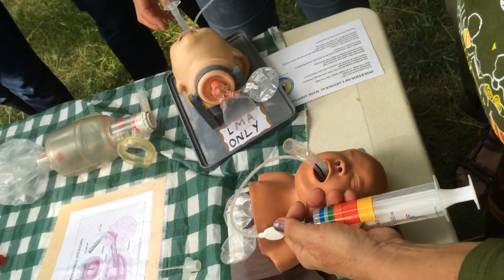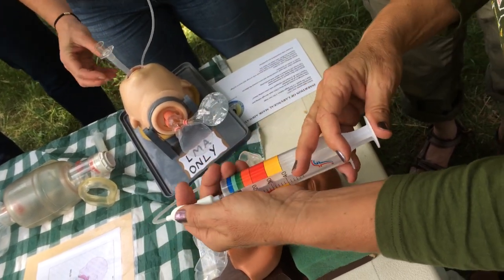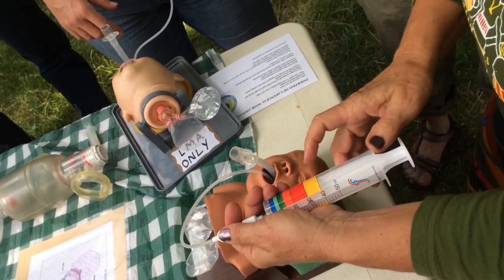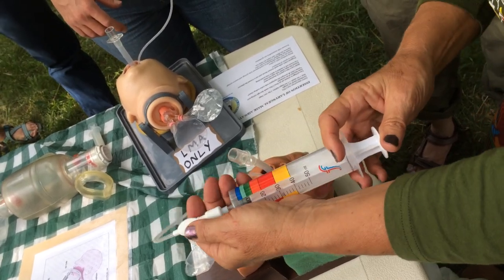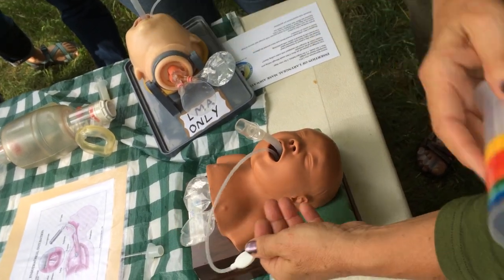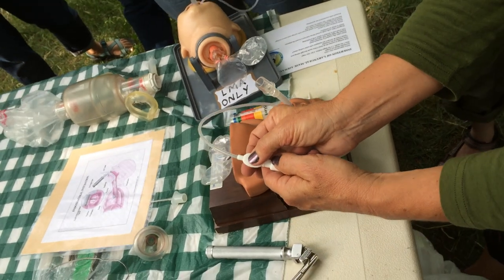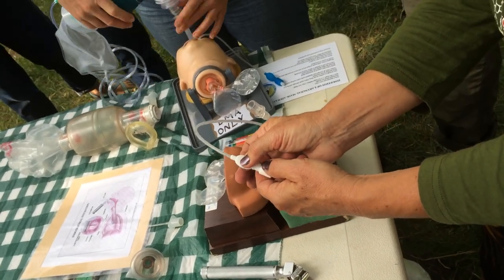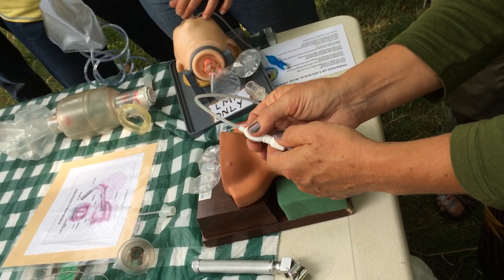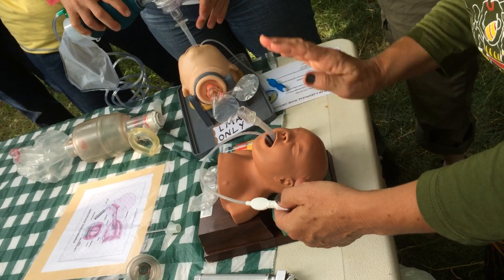You're in a hurry, right? So you're not going to worry about whether you do 2 or 3. You just want to make sure you don't see it pop up, because then you're going to have to put it in again. Okay? So you've got it in. And now you take this off, because again, it will come out and go in on its own. This is your indicator. I call this smishy. If it's smishy, you're good. If this is really hard, you're too full. And if it's flat, you didn't get your air in.